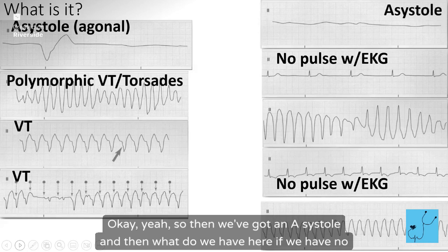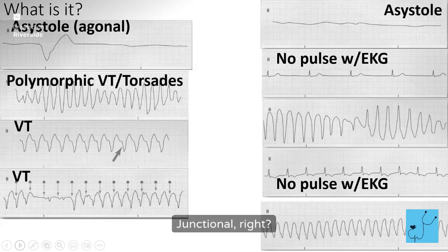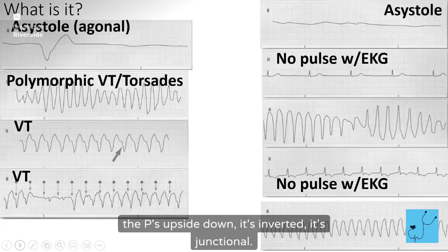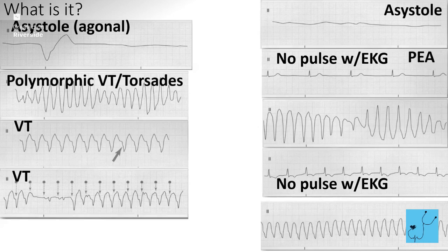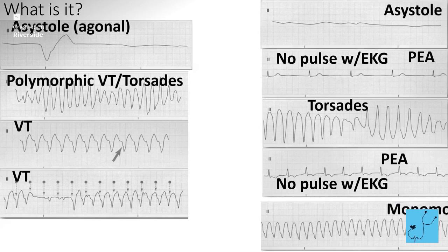Okay, yeah, so then we've got an asystole. And then what do we have here if we have no pulse? PEA. What is this rhythm though, without knowing they don't have a pulse? Junctional, right? It's missing the P. So junctional is either missing the P or it's upside down. I learned that because I didn't know. Karen was on that. She was like, when the P's upside down, it's inverted, it's junctional. I just assumed junctional. There was just no P at all. And that's usually what it is. But yeah, sometimes you do see the upside down P. Okay, and then we have another V-tach, another PEA. Yeah, another V-tach.